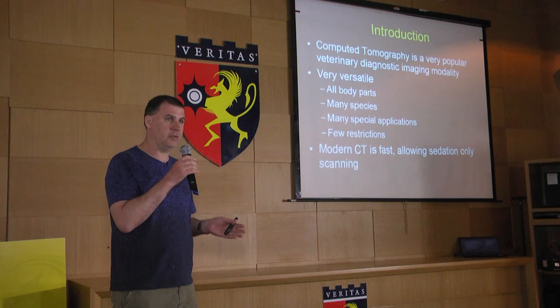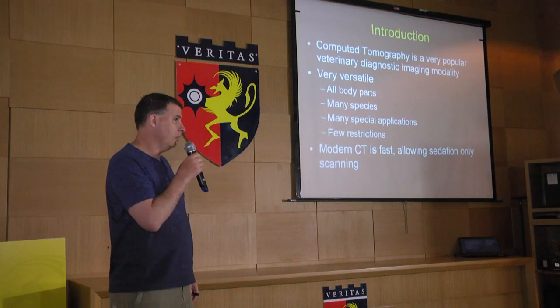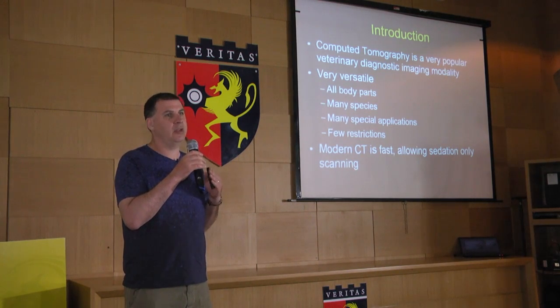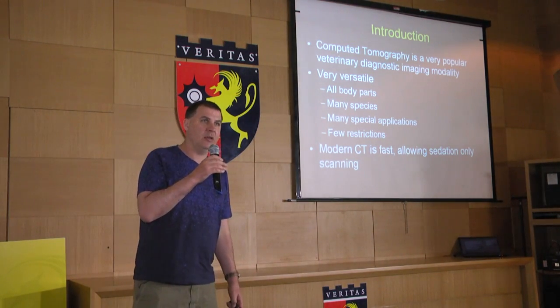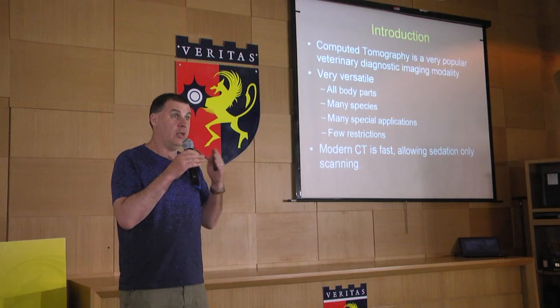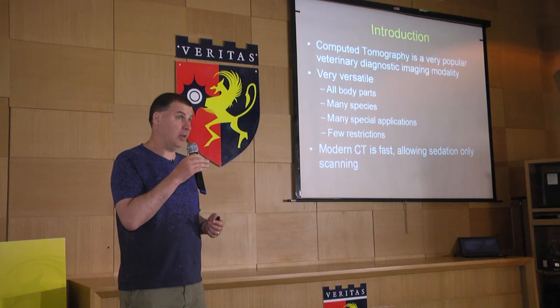There's lots of special applications you can use it for. You can measure different things, you can compare different things, so that is another advantage. And there are very few restrictions of why you couldn't use it. One of them is that there is X-rays emitted, so there's radiation involved, so there's always a safety issue with this. But in general, it's an extremely versatile tool, which I think is also why it's a very successful tool and why it's used so much now. Particularly the more modern CT scanners are also very fast, and therefore we can do an examination in between 1 and 2 minutes now.